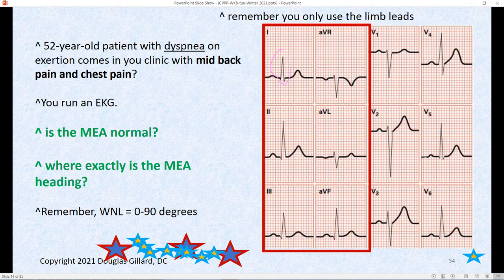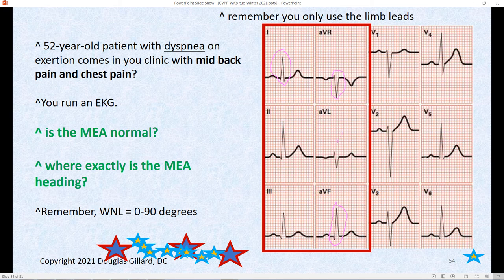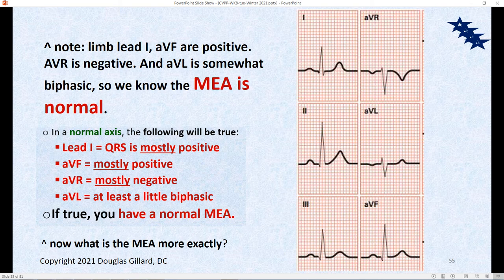Here's a 52-year-old who comes in with dyspnea — trouble breathing especially on exertion. When he walks up stairs he's panting and out of breath. You run an EKG. First question: is the mean electrical axis normal? Limb lead one has to be positive — it is. The peeper AVF has to be positive — yes, that's positive. AVR has to be negative — absolutely negative. AVL has to be a little biphasic — yes, it is. So this patient does have a normal mean electrical axis. But I want to know exactly where it is, since normal spans a big range of zero to 90.